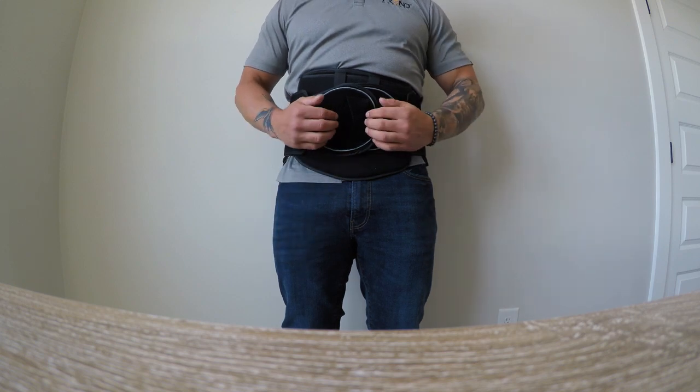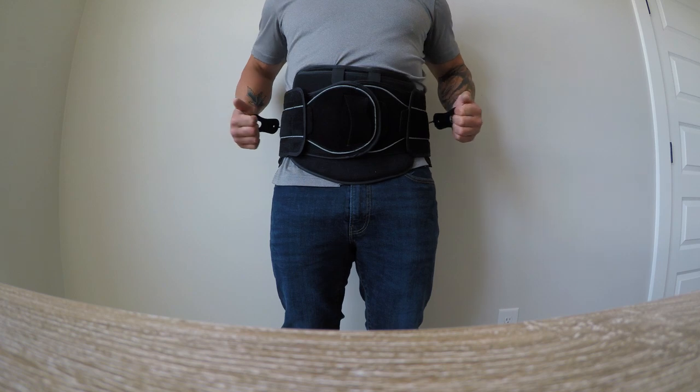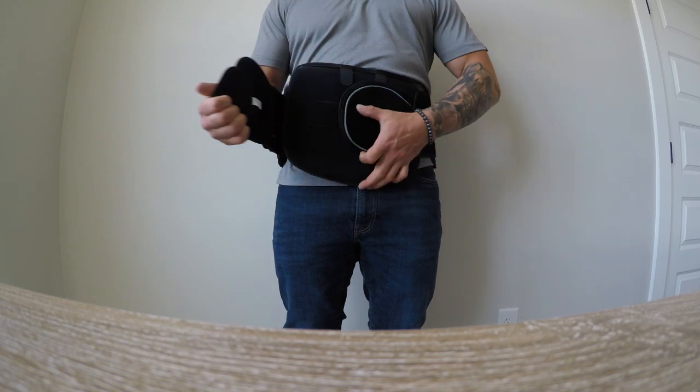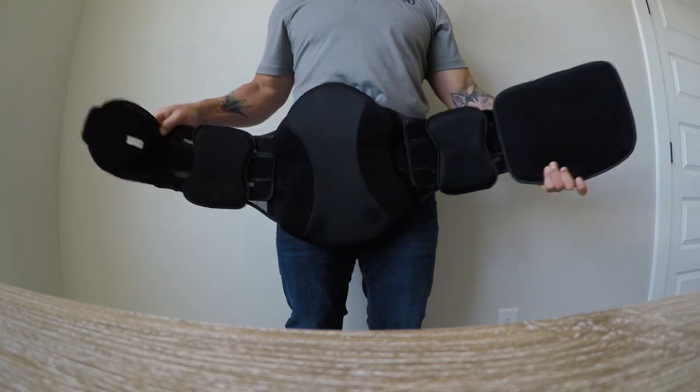When doffing the brace, all the patient must do is release the Velcro tabs and lie them back on their sides, which will reset the pulley structure. Un-velcro, take off, and the brace is ready for next time.